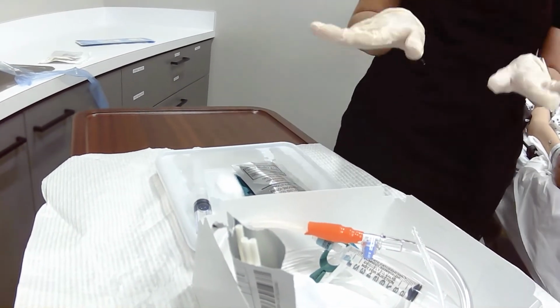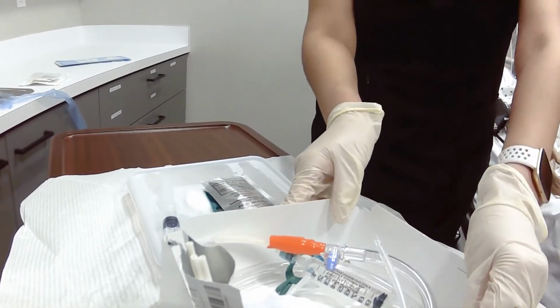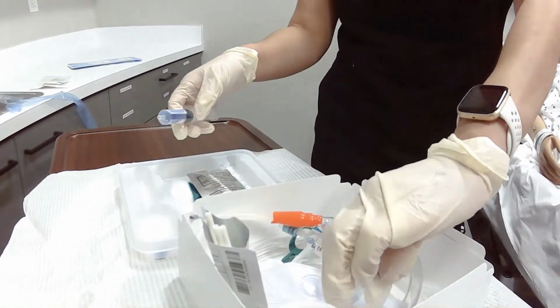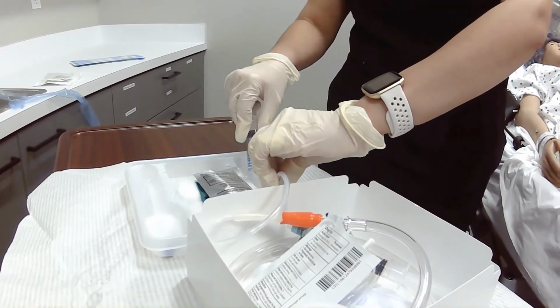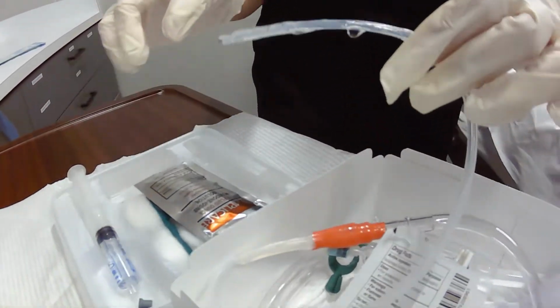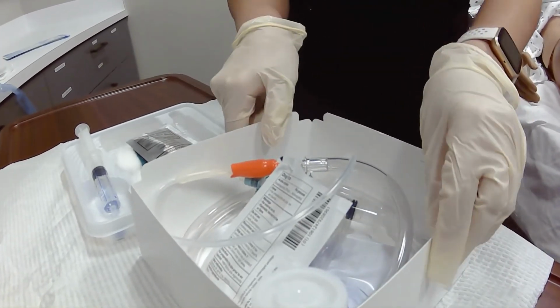Okay? So now that everything is prepared and ready to go, I'm going to bring my kit over. We'll pretend that I had already done that, just so it's a little bit easier when we insert it on the mannequin.